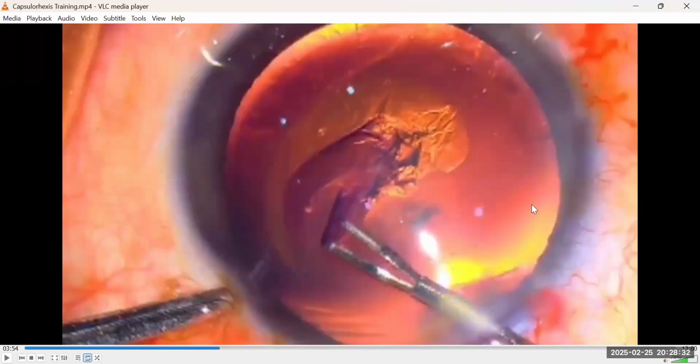Even if I want to drop, the best place to drop is exactly 12 o'clock, which is in front of me, such that when I want to regrab, I'll repressurize the eyeball with viscoelastic solution. And the base of the flap is directly in front of me. So this is 3 clock hours motion to 12 o'clock position. If I choose to stop it, I can drop my flap here and grab it from here. Or I will escort it to somewhere safe 3 clock hours from the margin of the incision.